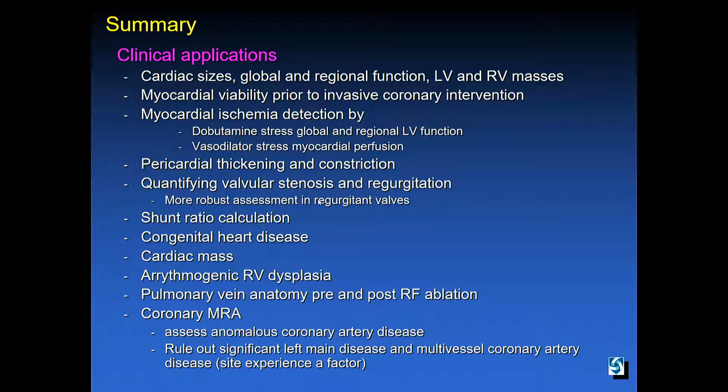I don't think we can claim that MRI is better than echocardiography, unless the echo window is insufficient in some patients. But MRI is very robust in looking at aortic regurgitation and pulmonic regurgitation. MRI is also a very good test to look at pericardial changes and to differentiate pericardial diseases from infiltrative conditions such as amyloid. The list goes on as listed below.